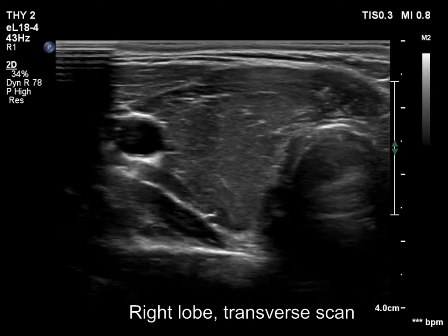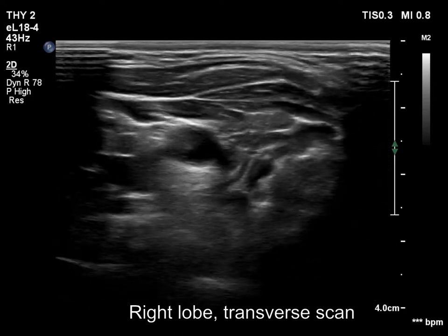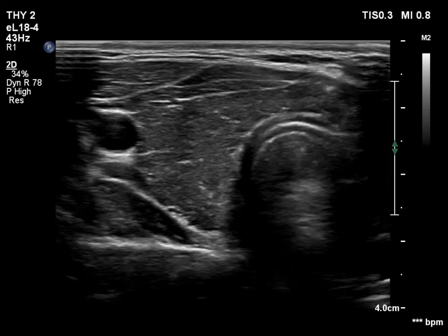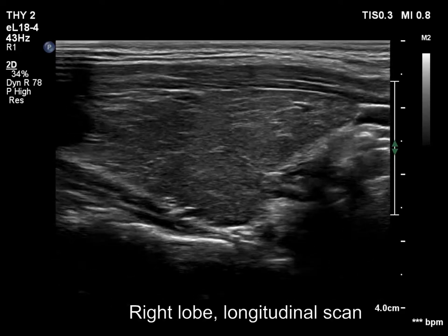The right lobe is moderately or deeply hypoechoic and presents fibrotic changes, both echogenic lines and granules.